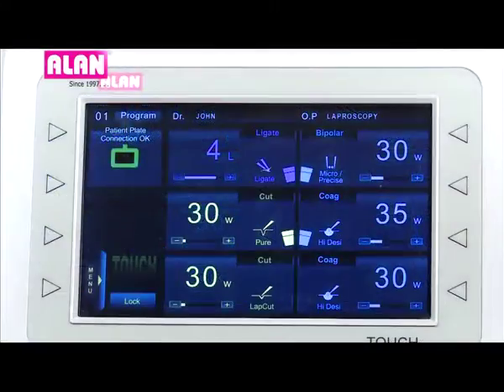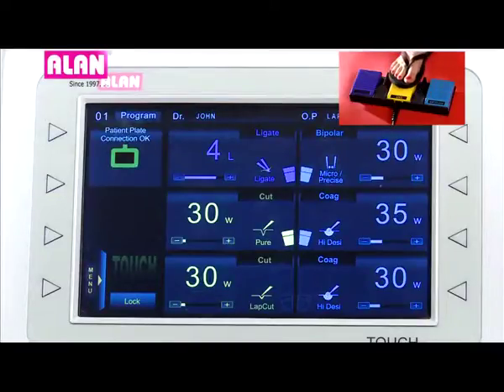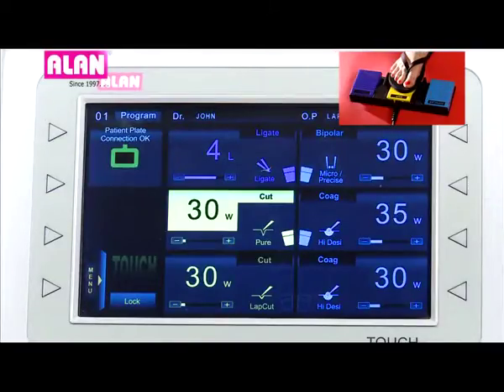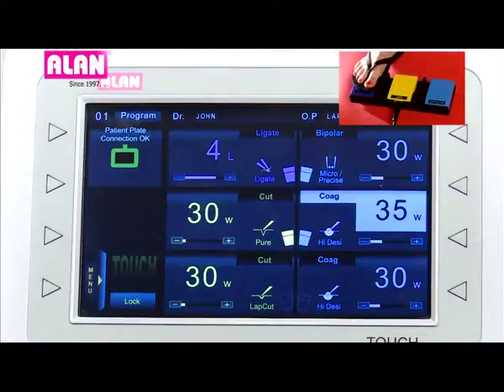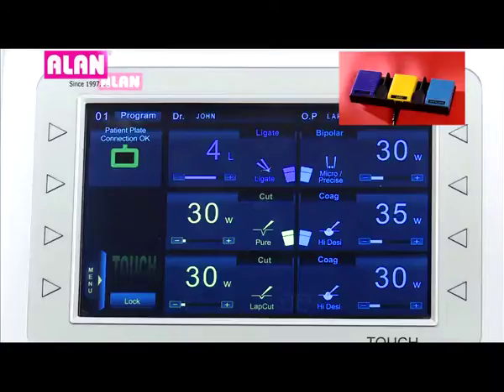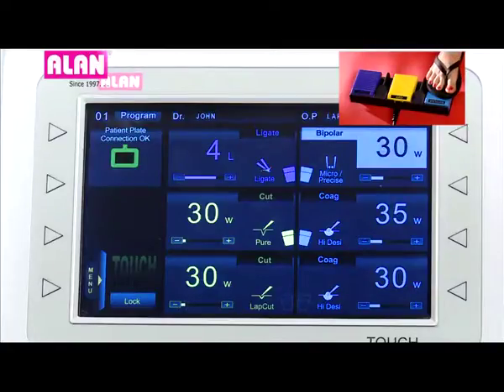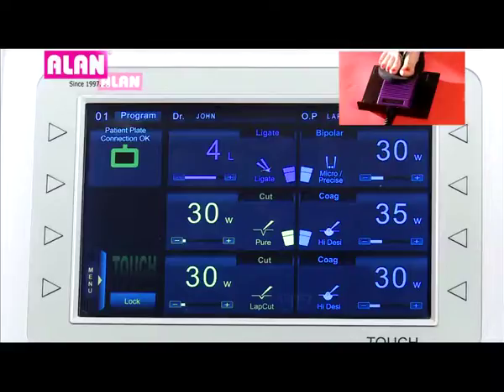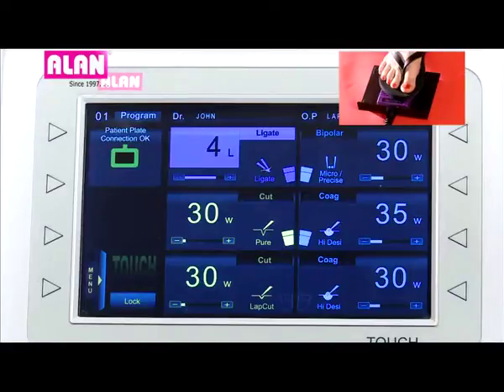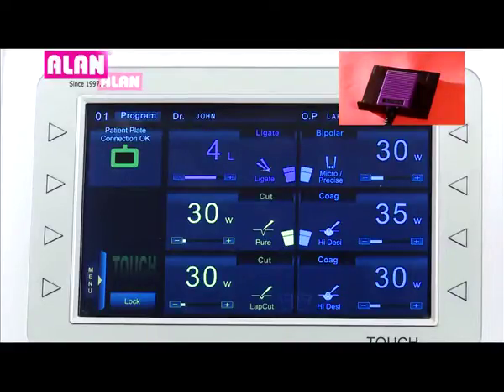Let's see the operations with the footswitch. Press the yellow pedal for monopolar cut, press the blue pedal for monopolar coag, press the light blue pedal for bipolar, and press the ligate footswitch for ligate.